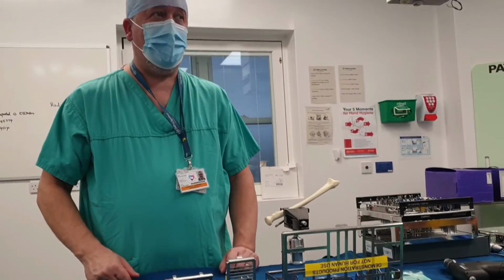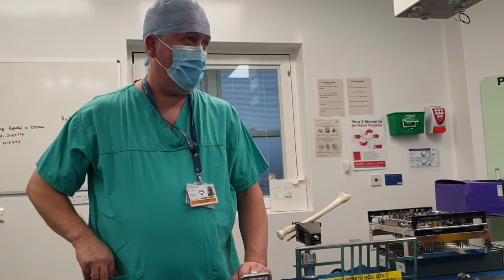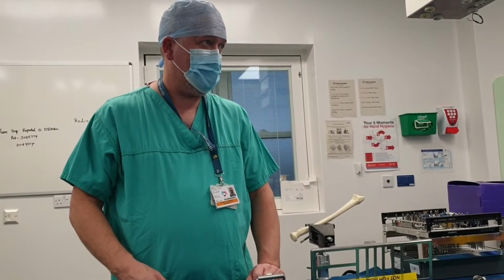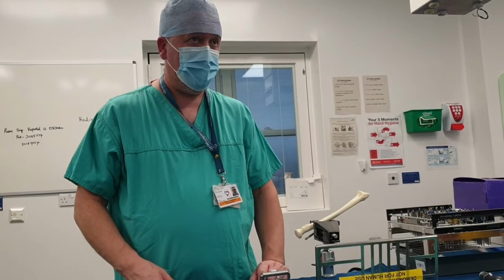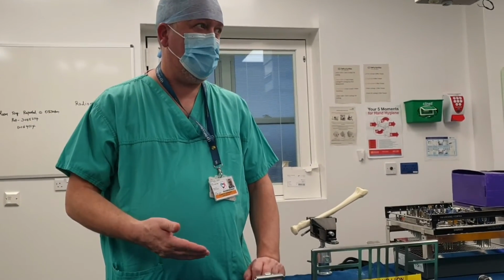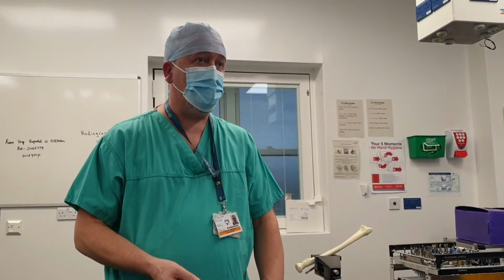The main thing to remember, when they ask for a 2.7, is we have a 2.4 Cortex. That is what's on this set. That's what it's designed for. And try to get them into the habit of accepting to use the 2.4.